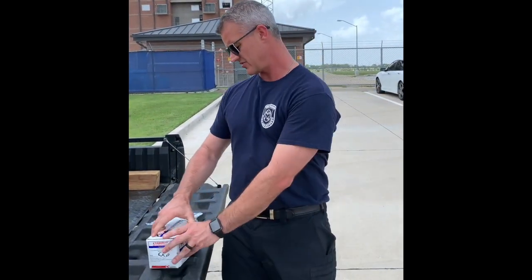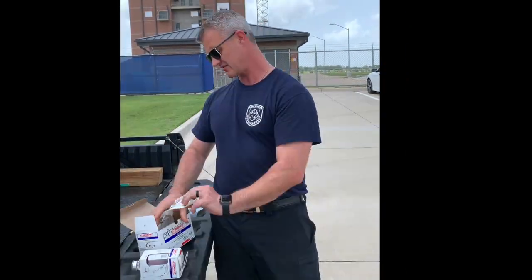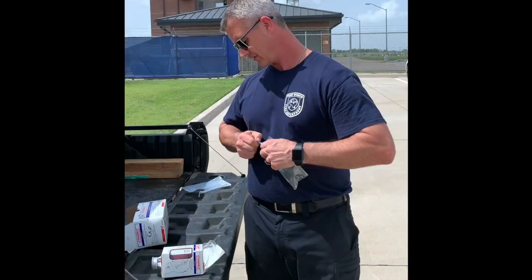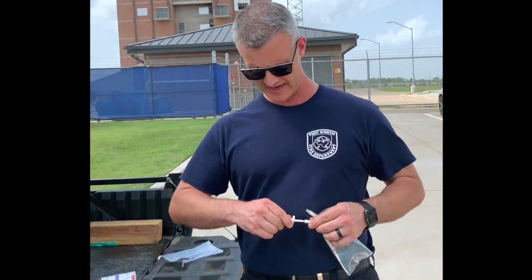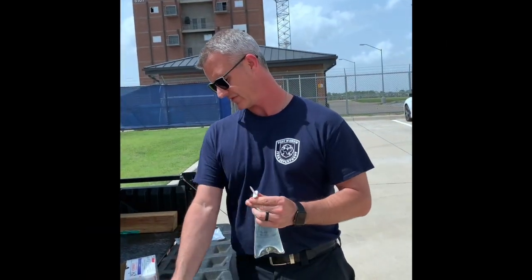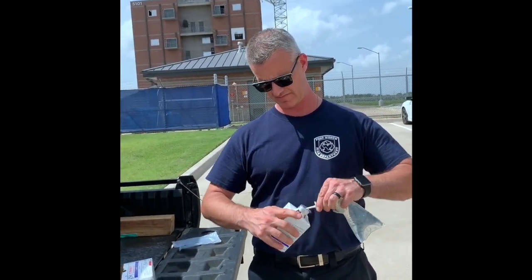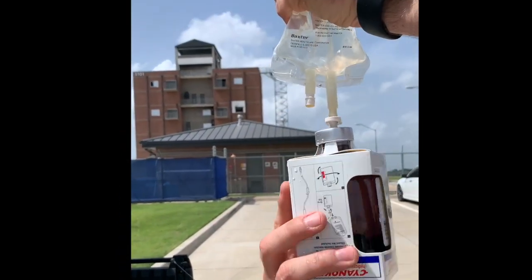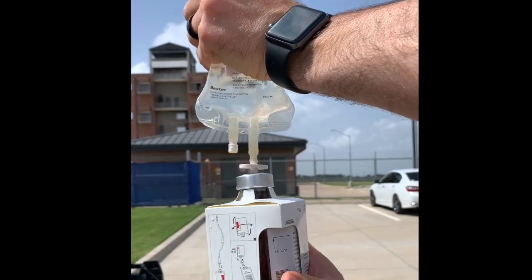When you're ready to use your Cyanokit, open the box up. You've got your drug double-headed transfer spike tubing. You're also going to need a 250 milliliter sodium chloride. Take your double-headed spike, spike the bag, and you're going to spike the cyanide kit. Fill that bottle up until you get to the fill line right there.